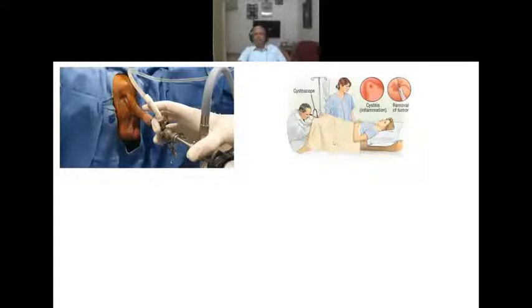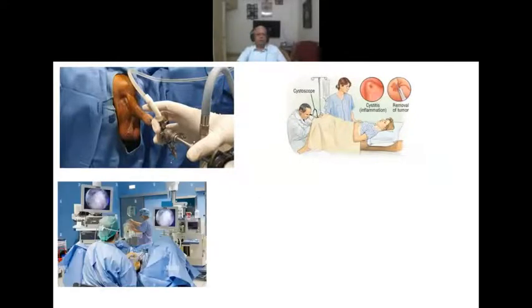the patient looks like a female patient. So this is for a female because of this eyepiece viewing. I could not get any other picture. I just pasted it there. This is the modern way of doing it with video monitoring. So the surgeon need not strain and look down and break his neck. You can watch the video monitor and then go ahead.